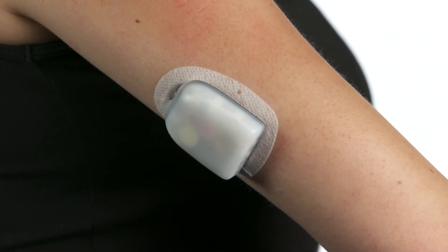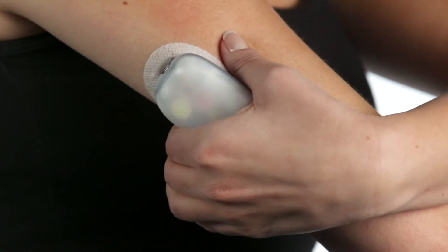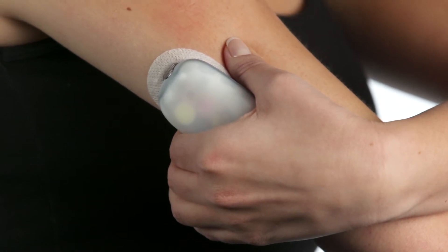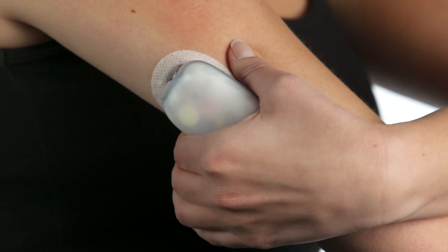For the pinching up method, place your hand over the pod and make a wide, gentle pinch around the skin surrounding the viewing window. You will need to hold this pinch until the cannula is inserted, so make sure you find a comfortable position.